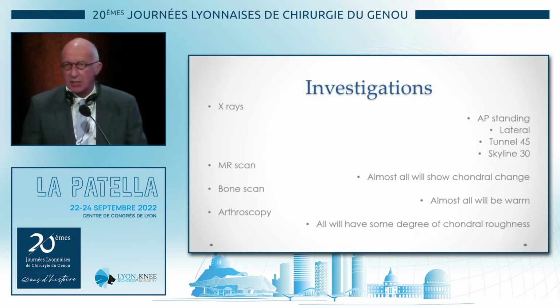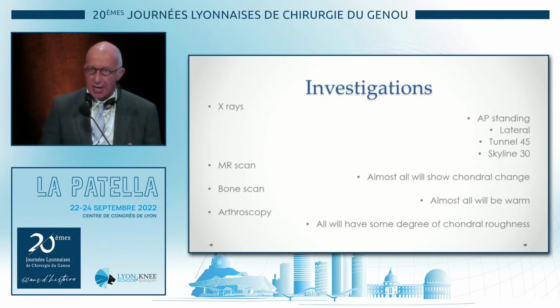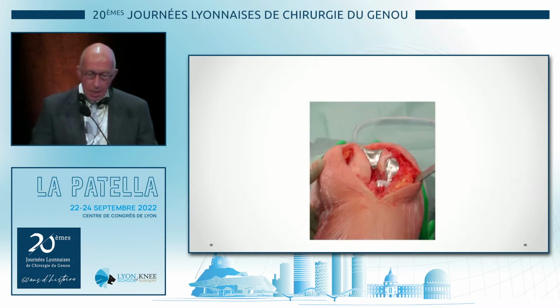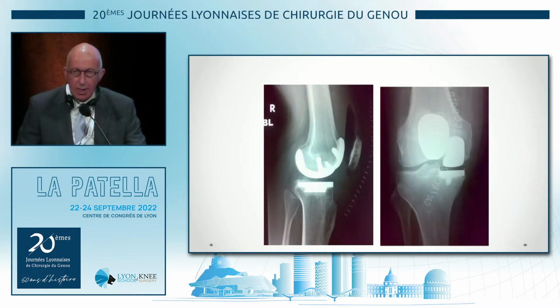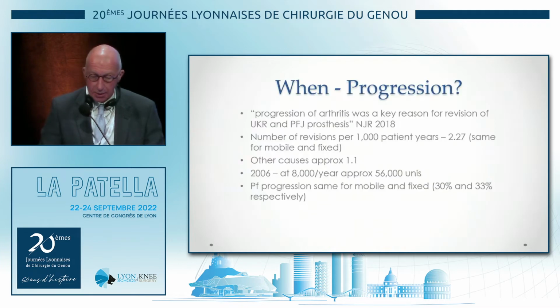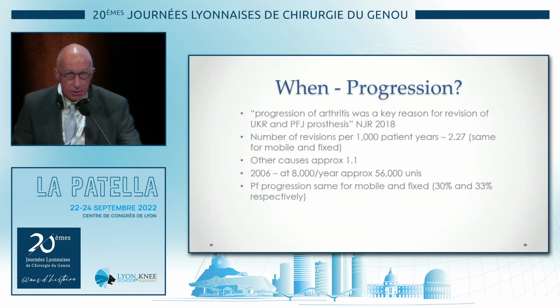The investigations are very simple. I tend to use X-rays only. You want to see bone-on-bone contact. This is the same indications as you would use for a total knee. And of course, you can produce a perfect solution with a bicompartmental implant that allows you to address both the patellofemoral disease and the medial compartmental disease.